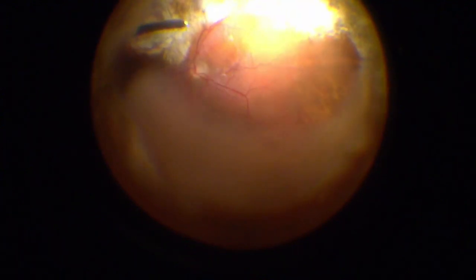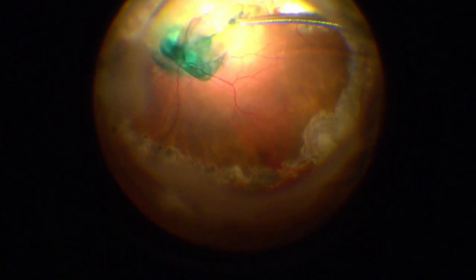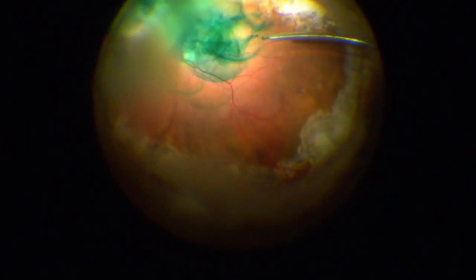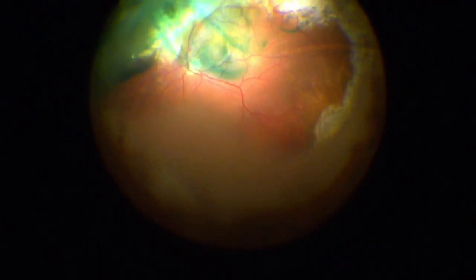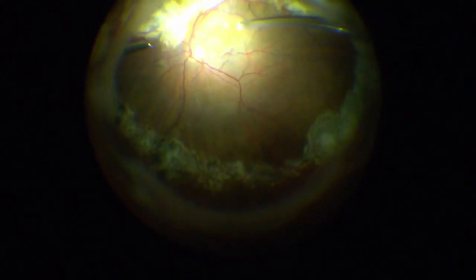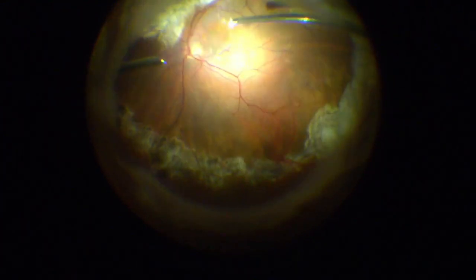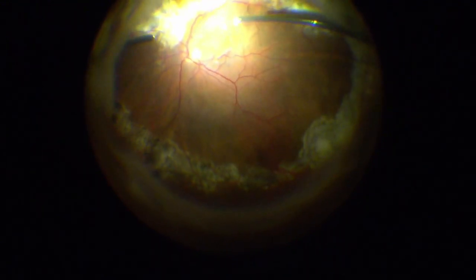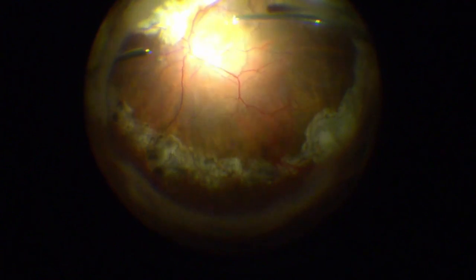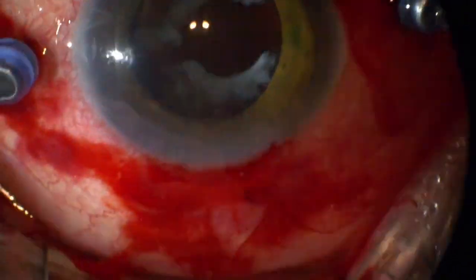Let's take the ICG dye. Okay, and we're going to put our green in. We know the vitreous is already off. Let the green fly around as we aspirate it out of the eye. So the green here is going to help us see the ERM, the ILM. We know the ILM is the last layer before the retina, so that's a good dissection plane. Then we're removing all the pathological tissue. And we're going to use our PIC and reusable forceps for this case.